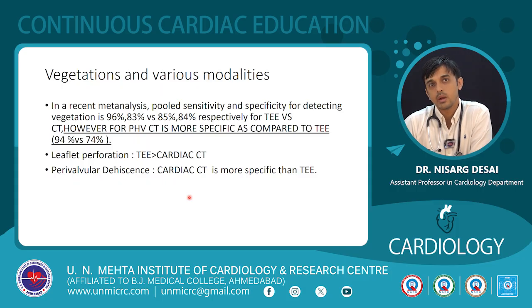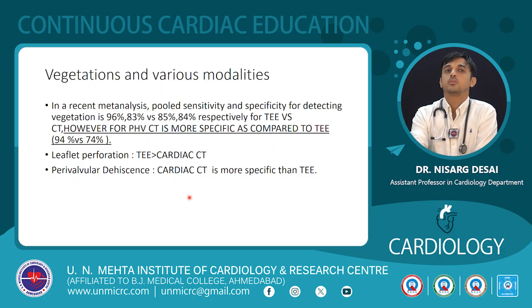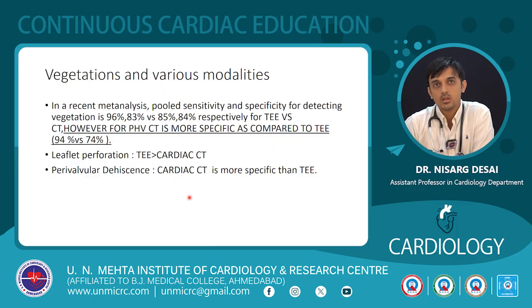In a recent meta-analysis, the sensitivity and specificity for detecting vegetation when comparing TE versus CT was 96% sensitivity and 83% specificity for TE versus CT, but that is for the native valve. If you are evaluating the prosthetic heart valve, CT is more specific as compared to TE.